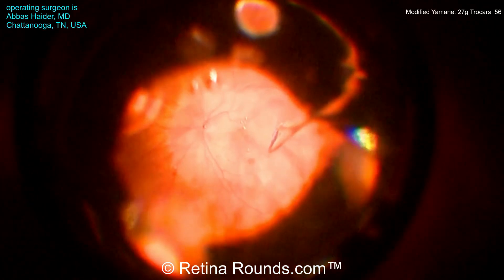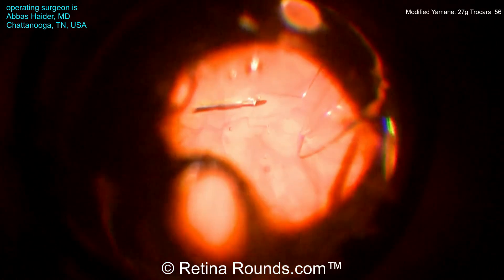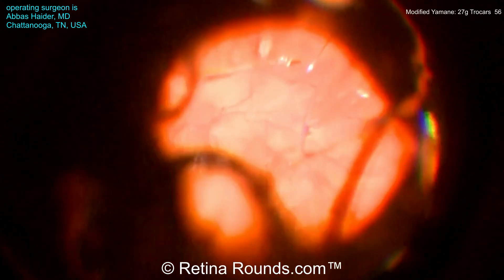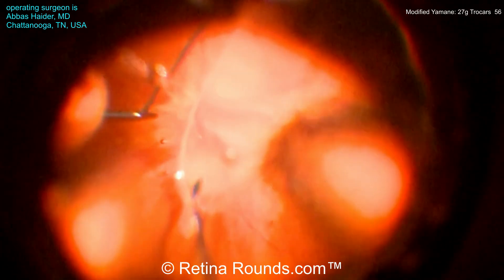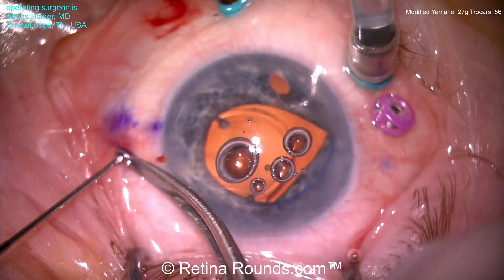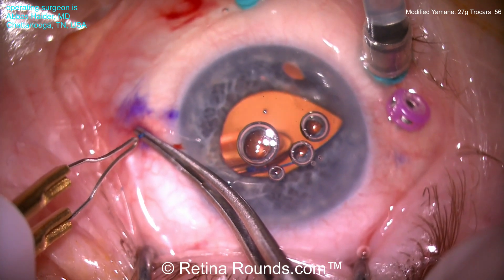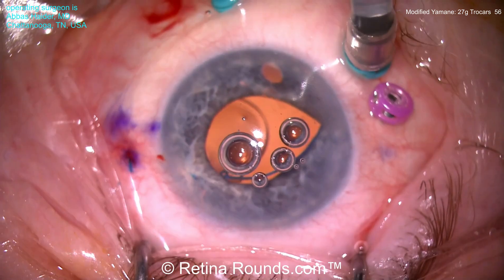Going to a posterior view, you can see that the intraocular lens is dangling in the vitreous cavity and the haptic happens to be oriented in such a way that it does not need to be rotated. You do want to make sure that the haptic is in the reverse S configuration. Grasping the tip of that haptic, he's now slid the trocar up the shaft of the Max Grip forcep, externalized the haptic, and is using a low-temp cautery to create a small flange.